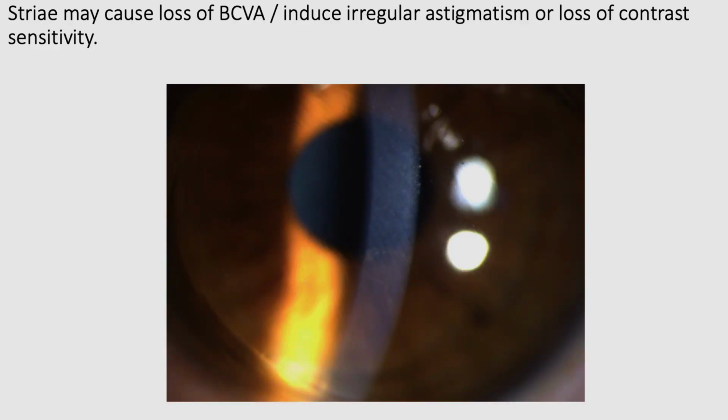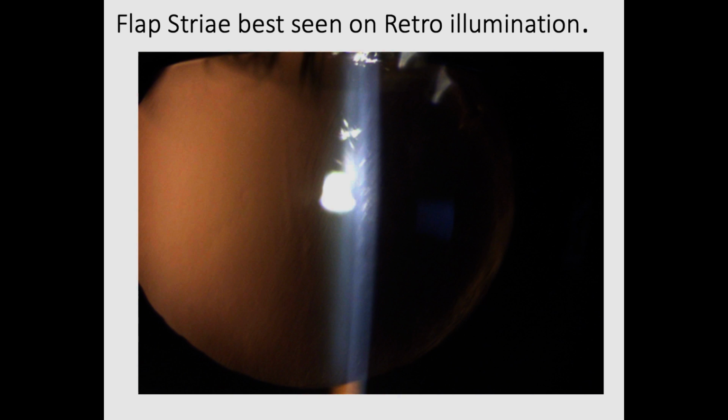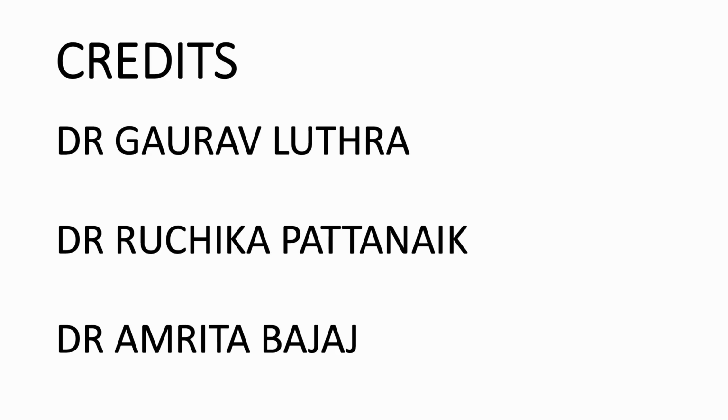To conclude, I have shown various situations and different techniques used in the management of LASIK flap striae, and whatever works best in the surgeon's hand can be his personal preference. Early recognition and treatment is associated with better visual outcome and reduced risk of developing fixed folds.